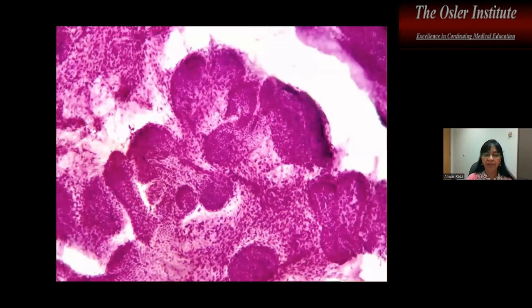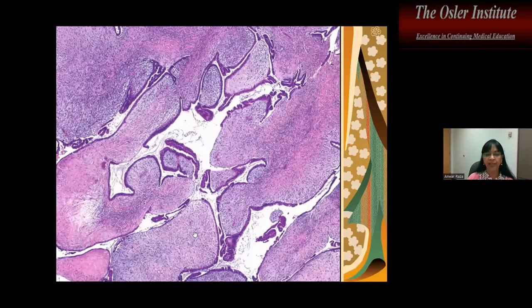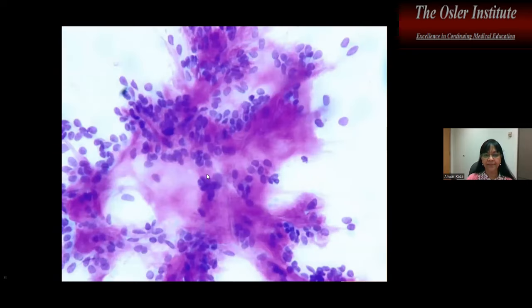Okay, and then sometimes you have these biphasic tumors, right? So you have two components. If this is from the breast, you can see the epithelial component, and there's a lot of the stromal component. So very cellular stroma here, right? So fibroepithelial lesions with hypercellular stroma. Then in the breast, this would be a phyllodes tumor where you have these epithelial as well as the stromal component, right? So phyllodes tumor would give you this appearance.